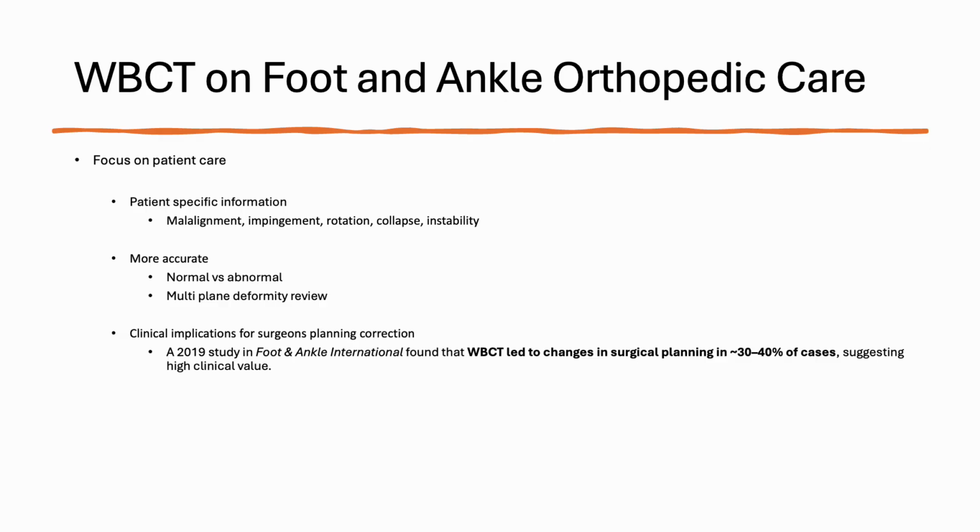I think what really changed my opinion was a study on clinical implications for surgeons. A study in 2019 in Foot and Ankle International found that weight-bearing CT scan led to changes in surgical planning in roughly 30 to 40% of the cases. It suggests that you will change your surgical opinion and plan based on getting a weight-bearing CT scan versus just standard x-rays. That's almost 50%, and I typically agree with this.